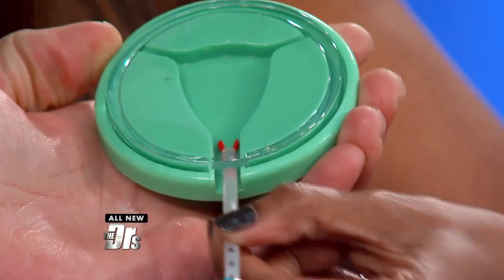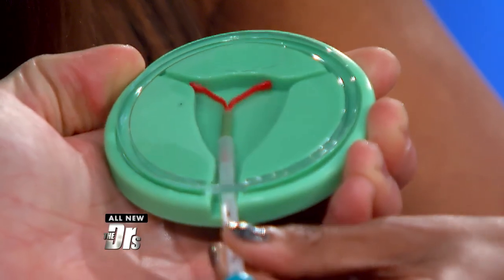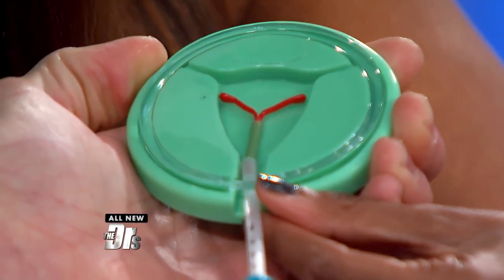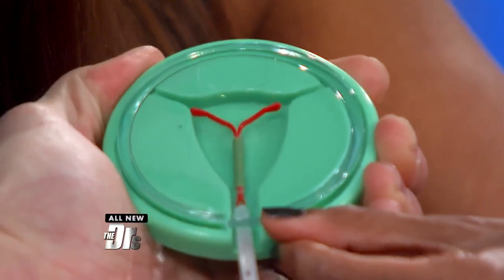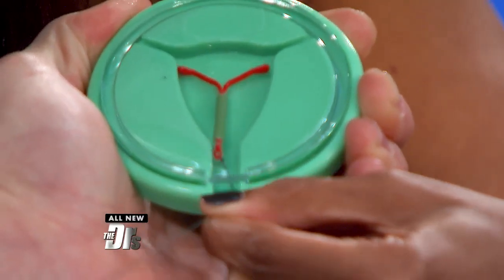So basically, this is your uterus, and this is the bottom part of your uterus called your cervix. We simply put the IUD device in, and when we pull back, the IUD stays in your uterus. And then the strings come through your cervix.